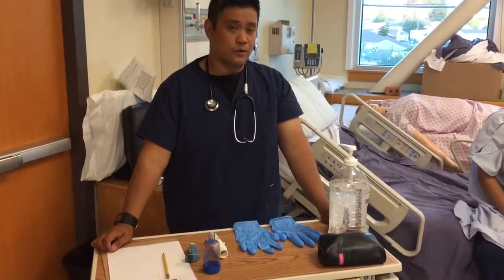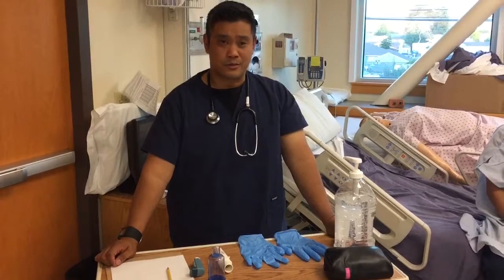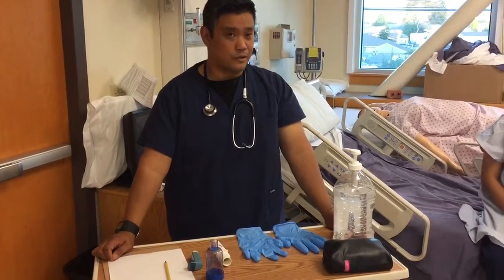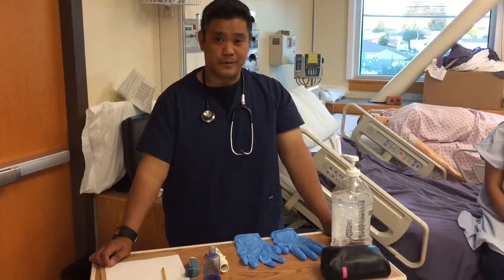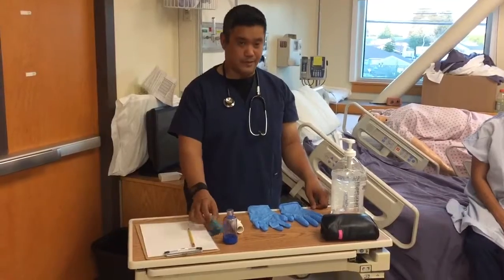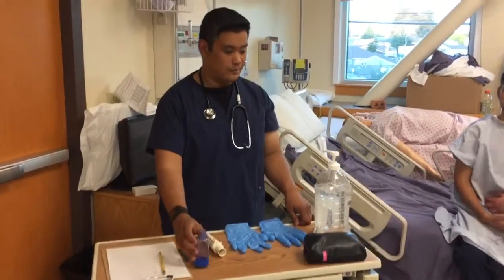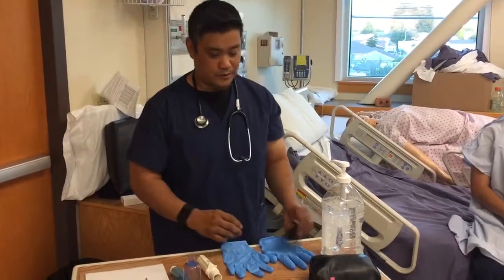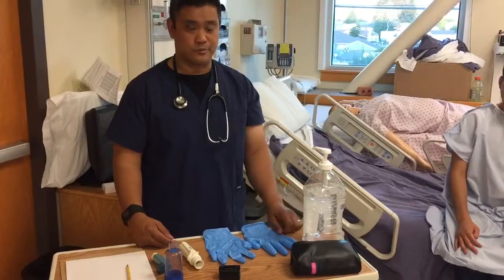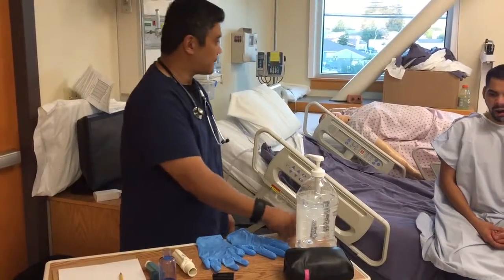So first off, before going into the patient's room, I will check their chart. I will check the doctor's orders and any other pertinent information such as labs, history that might impact the treatment. Once that's done, I would go ahead and gather my equipment. It would be the inhaler, peak flow meter, holding chamber, blood pressure cuff, as well as a pulse ox. When we have everything, go ahead and enter the room and knock on the door.